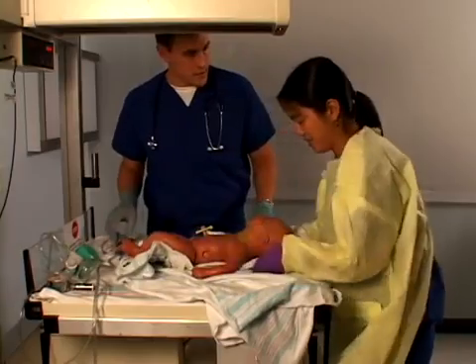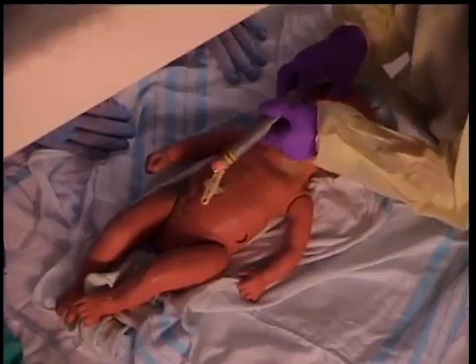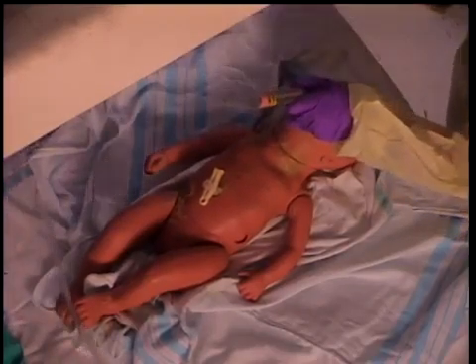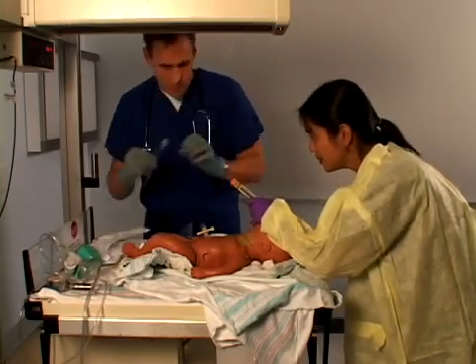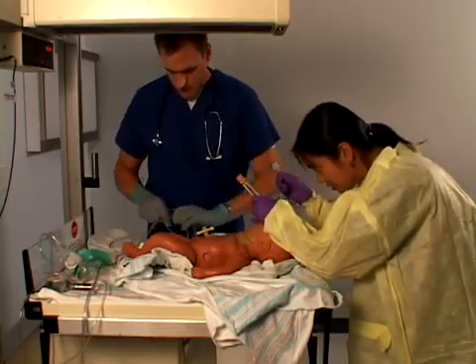When the baby isn't crying, let's go ahead and intubate. If the baby is not vigorous, if respirations are depressed, tone is poor, or heart rate is less than 100 beats per minute, tracheal suction should be performed. And then the tube. The newborn should not be dried or stimulated first. See the cords.